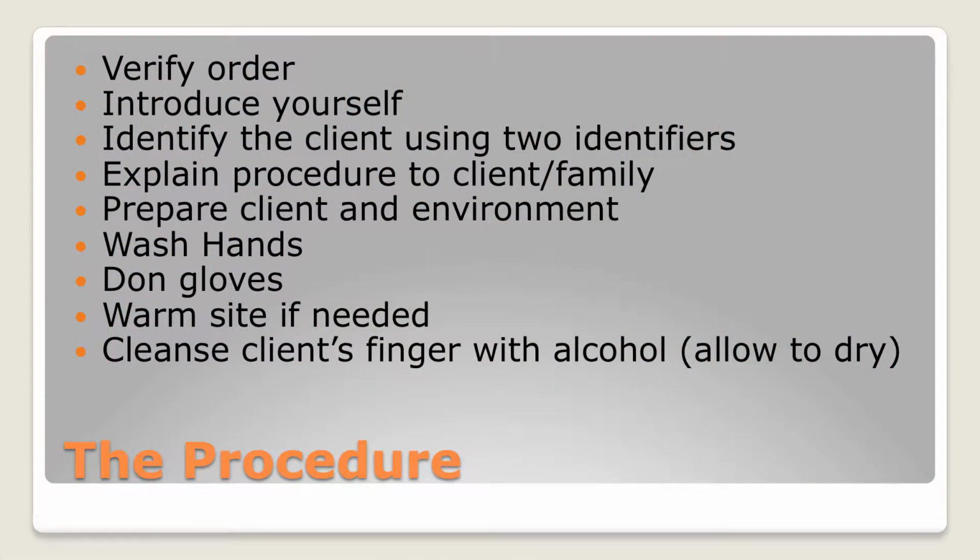Another way that you're going to prepare the client and the environment is, like I said, make sure that they wash their hands, make sure they understand what's going on. If their hands are cold, you're not going to get as good a sample. You're going to have a really hard time getting it. So you want to make sure that their hands are warm to touch. If they're not, you can run some warm water over them, or you can hold their hand in yours for a little while and get some blood flow in there, get a good capillary blood flow going. If you don't, you're not going to be able to get it.